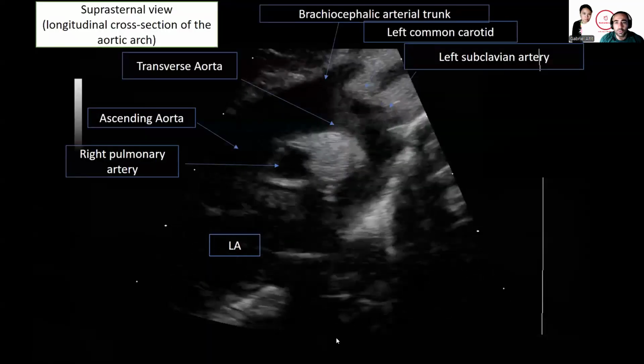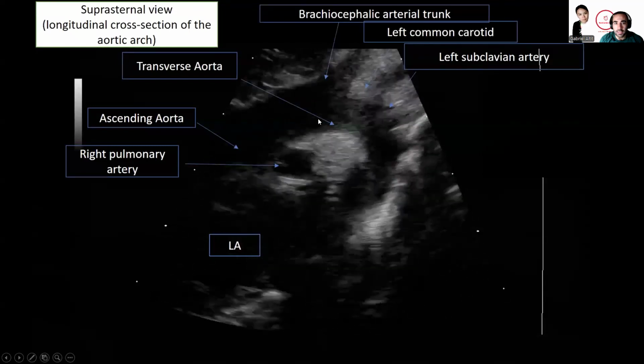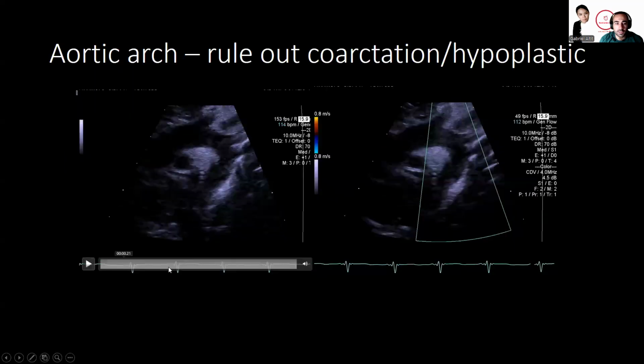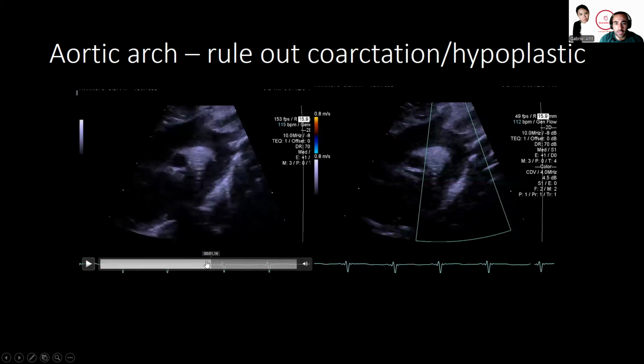And so that's an example where you see this sugar cane. In the middle, we transect the right pulmonary artery. We see the ascending, transverse, and descending arch. And what we call the isthmus is typically the zone where the PDA will connect. And it's this zone here. It's this little zone here.